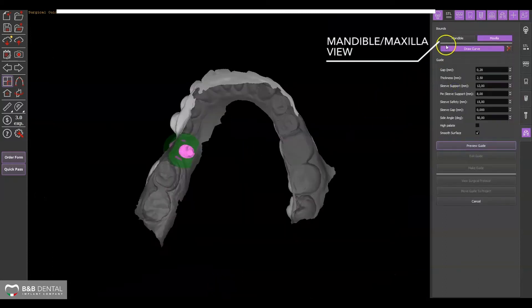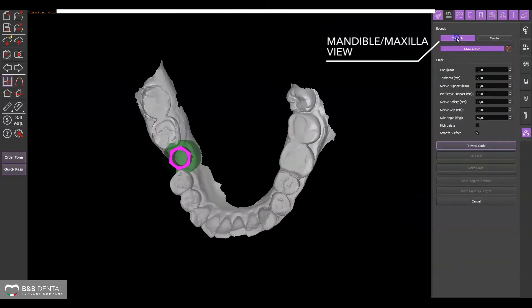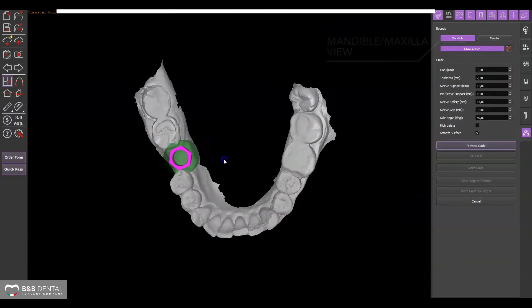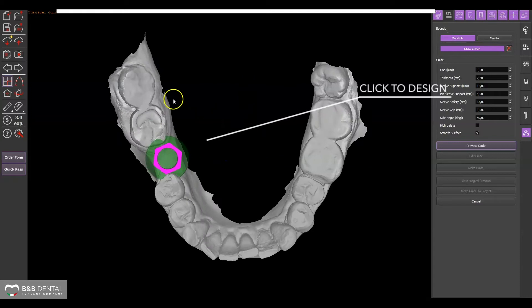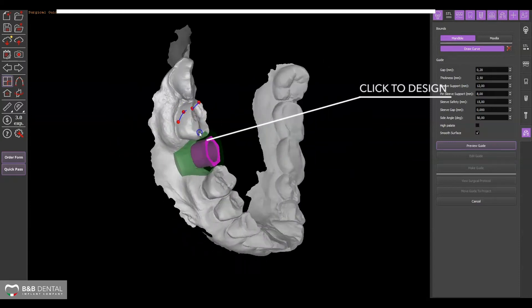Depending on the work arch, select the mandible or maxilla to adjust the preparation surface template display.